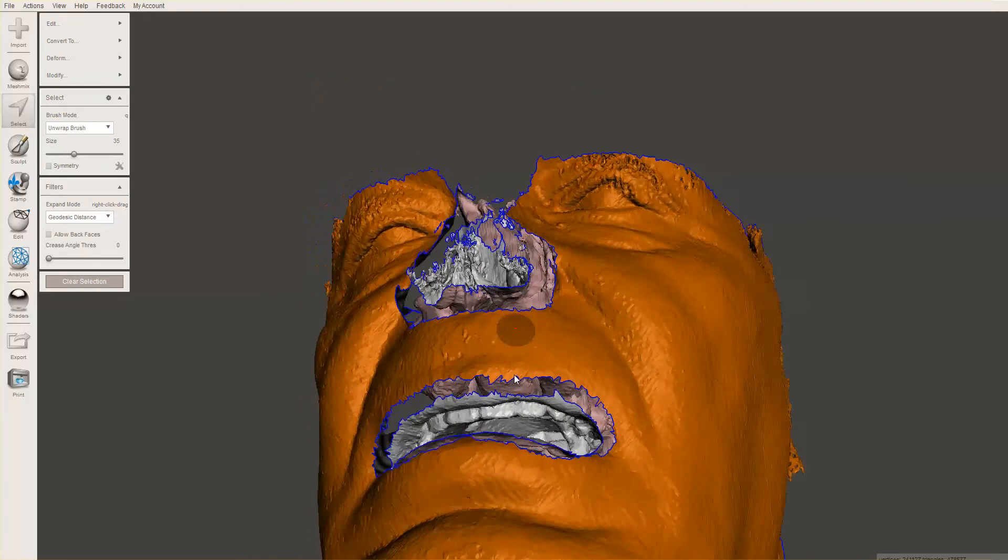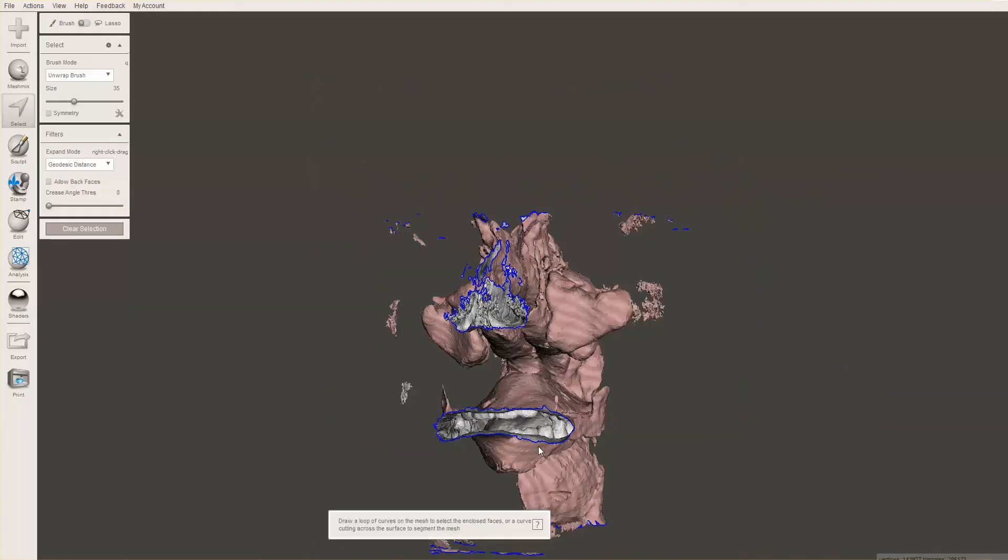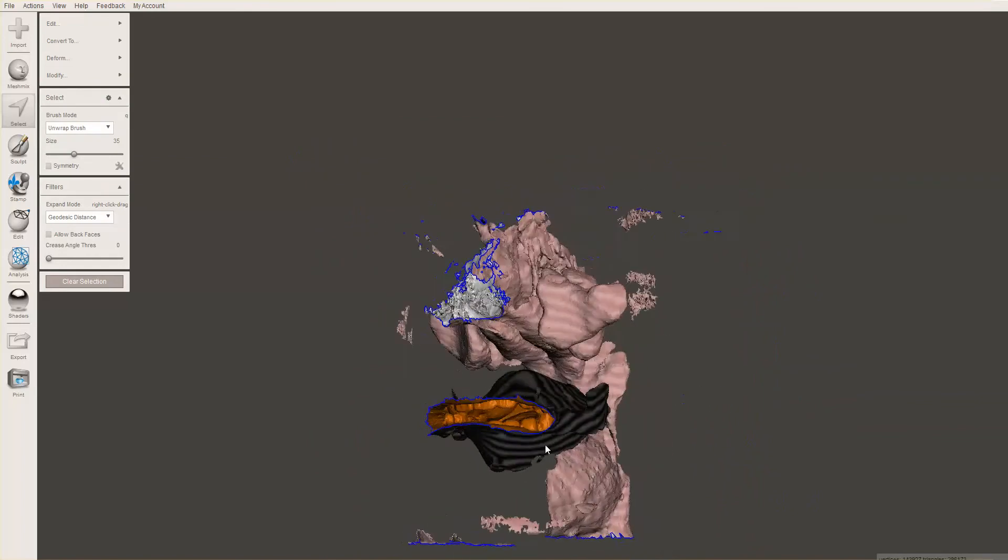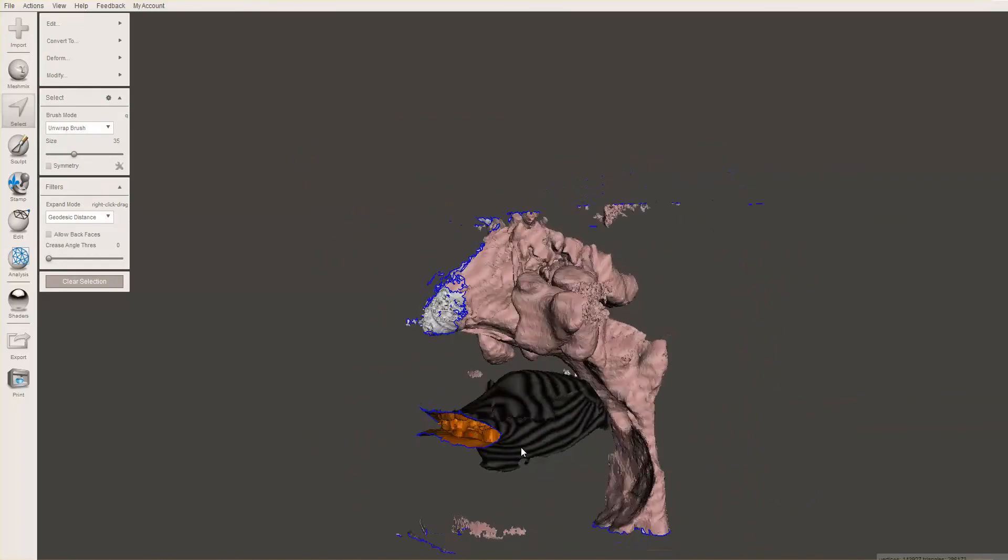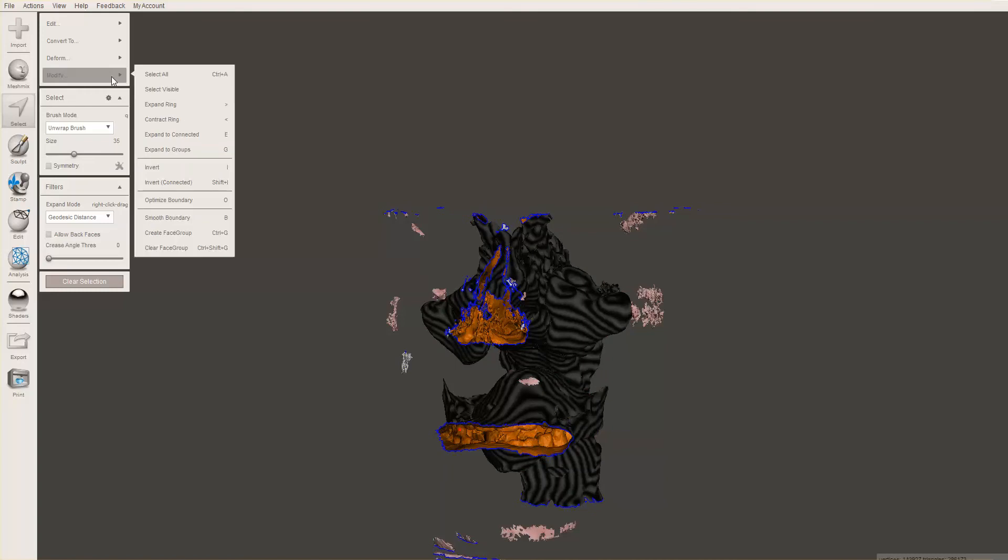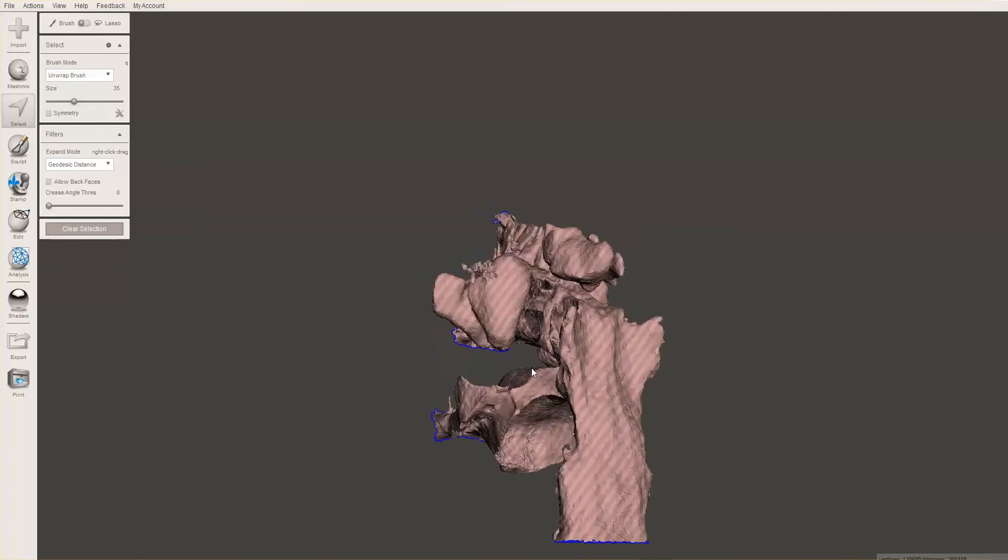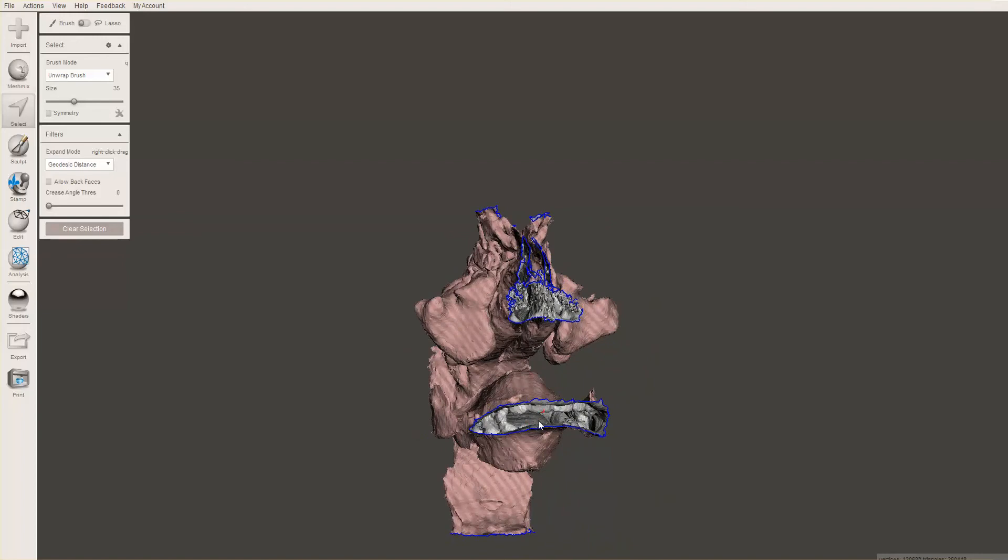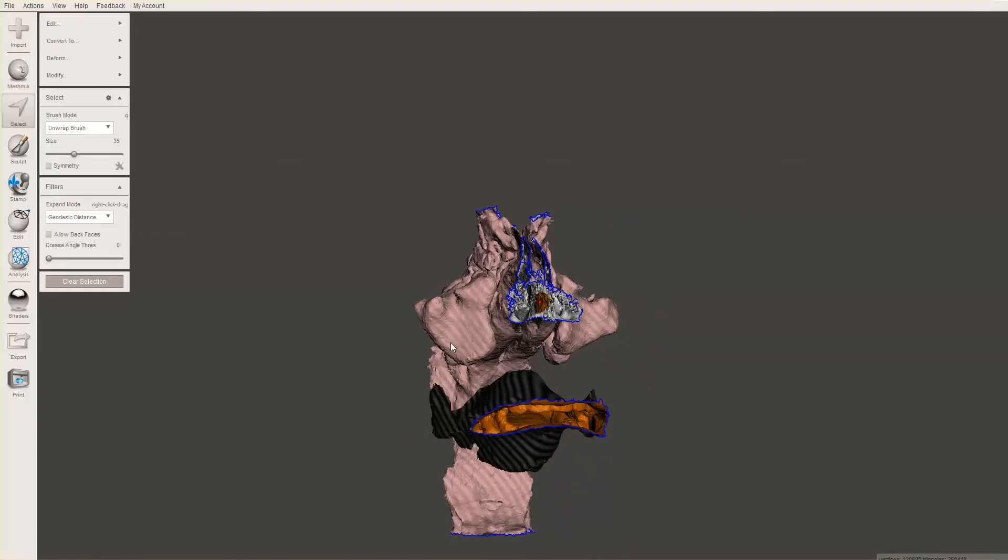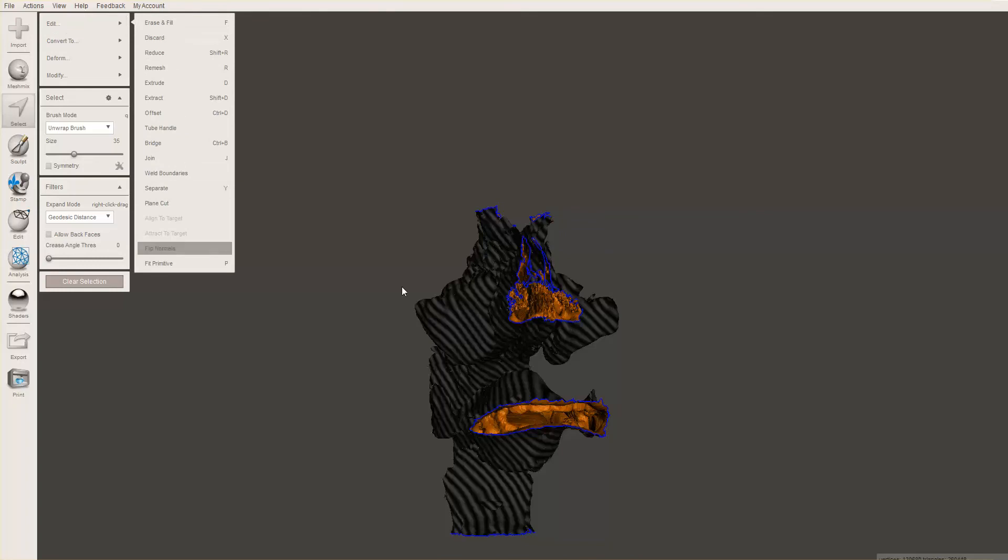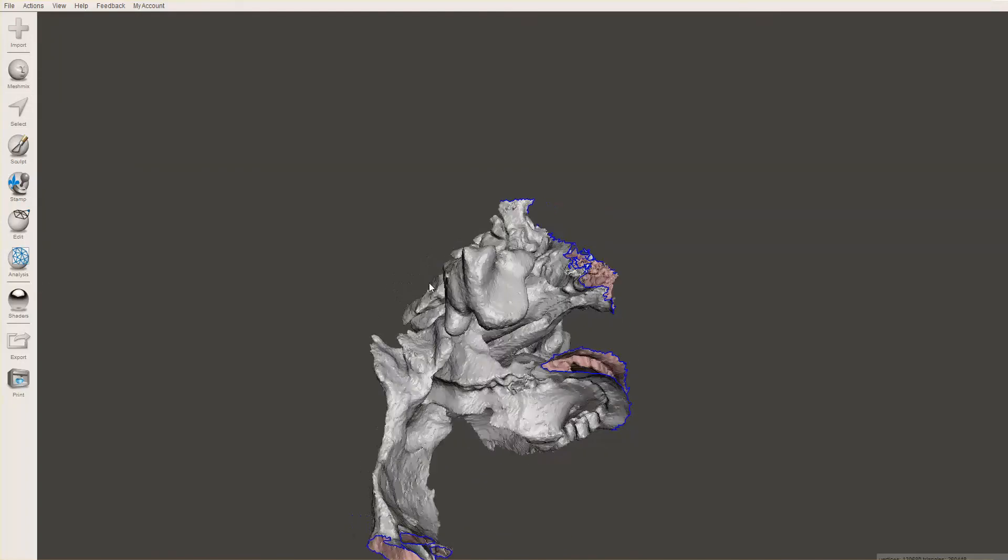And there we go. So now I've cut away all of that, and I can just push delete. And basically what I want to preserve is the mouth. You can see there that the throat has closed up, separating the air in the mouth from the air in the throat. And then obviously all these nasal passages. So I've selected them. If I want to delete everything else, I could say invert, and that would deselect it and select all the opposite surfaces. And so now I have this to work with. And this is essentially an inverted STL of the airway. If I select again all of these surfaces, I can come up here to edit and flip normals. And now this STL has been turned right side out.